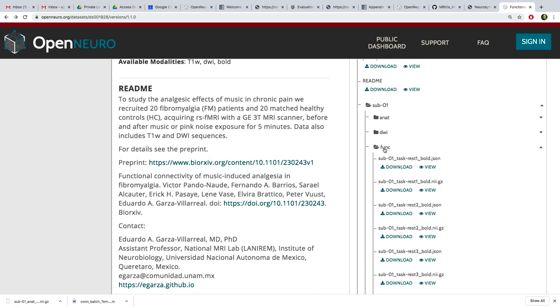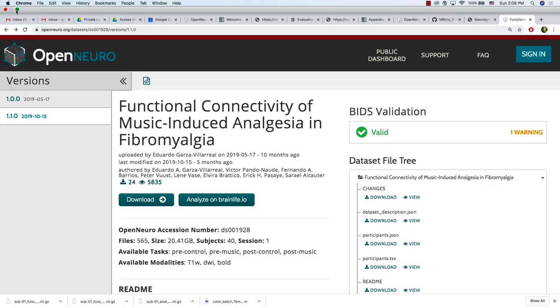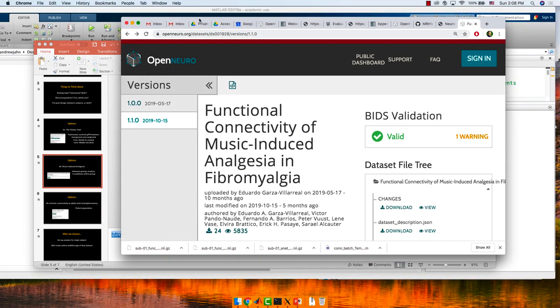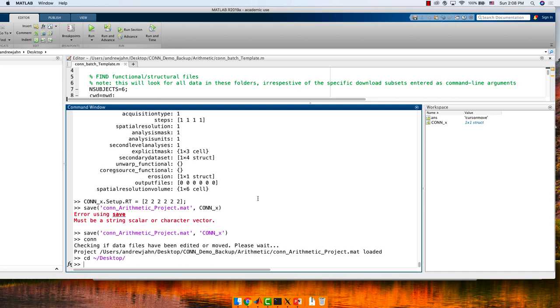Let's download the bold one nifti and bold two nifti. From your desktop, let's create a new folder. If you're on the MATLAB terminal, type 'cd ~/Desktop' and then 'mkdir music_analgesia' or whatever you want to call it.